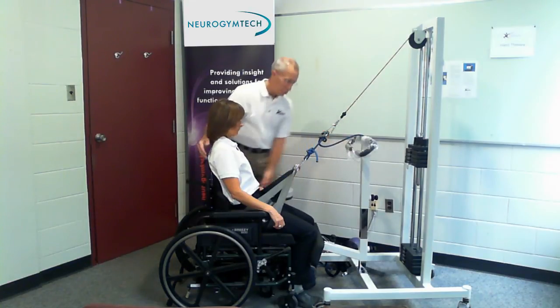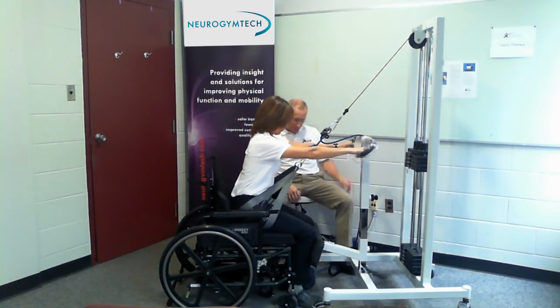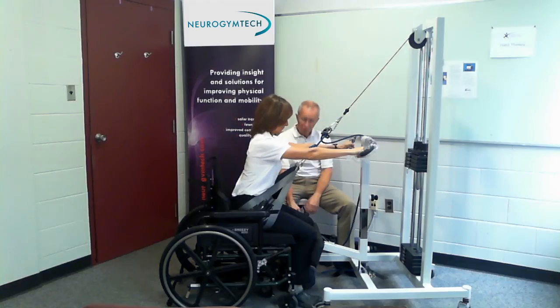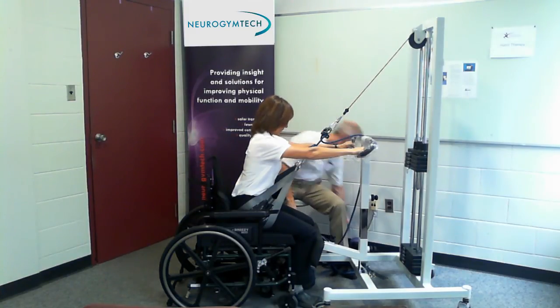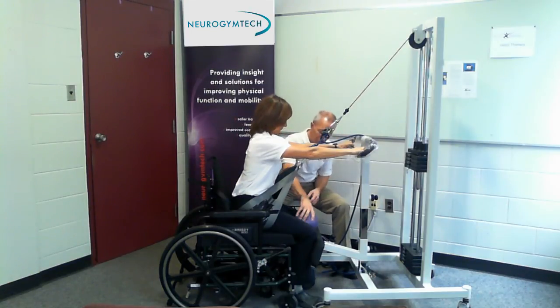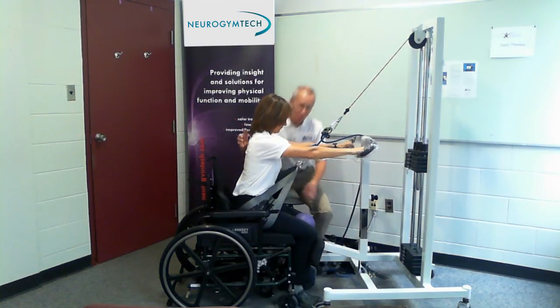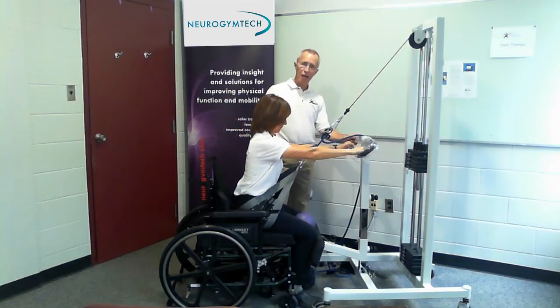She's ready to train — put her hands up here. A couple of things to watch: the most important position for the clinician is on a therapy stool, just to the person's side. You want to watch the ankles — make really sure that the ankles are straight. If you're standing somebody who hasn't stood in a while, their ankles are weak. If they roll over and stand up, you could have a problem. You also want to keep the knees perpendicular to the pad — that's really important. If people have a weak leg, you can put a therapy ball between them to make sure the knees are perpendicular.